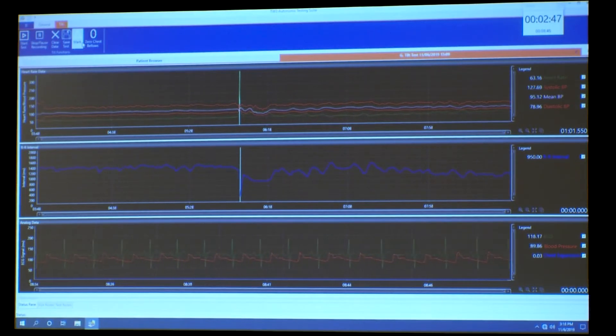We're getting 122 over 88 and we're close — within range. He's oscillating; I took three readings and there's variability between them. If you're doing a POTS evaluation, one reading might be here but the next might be there.